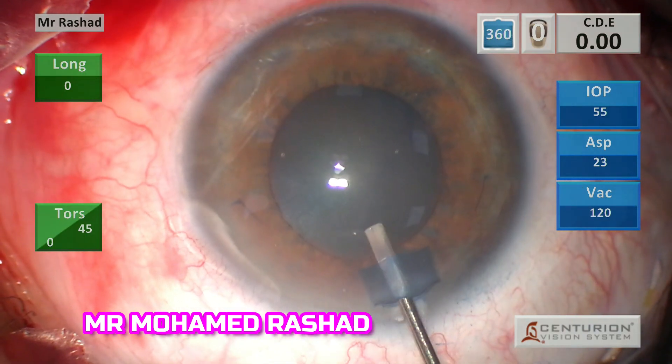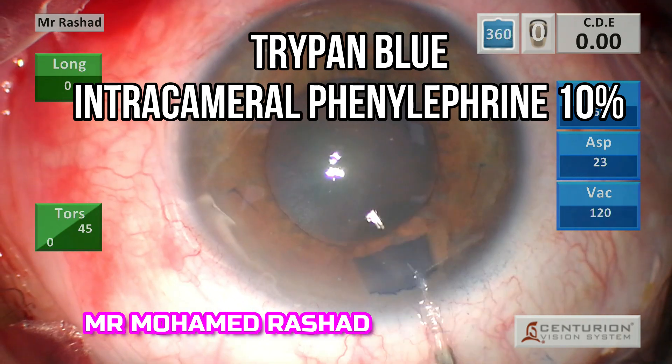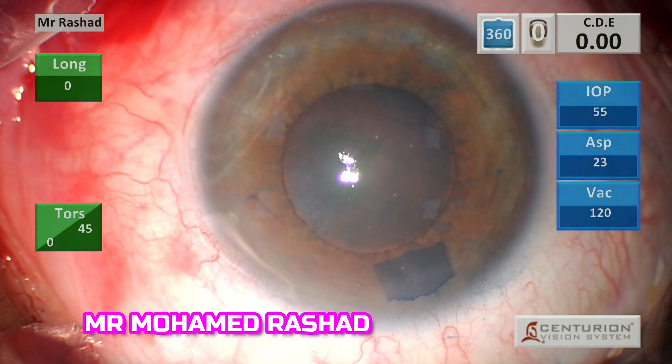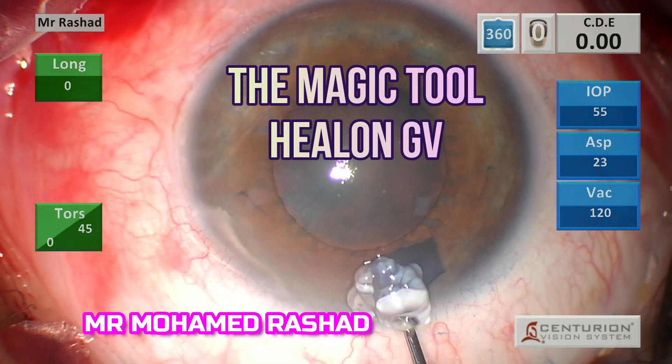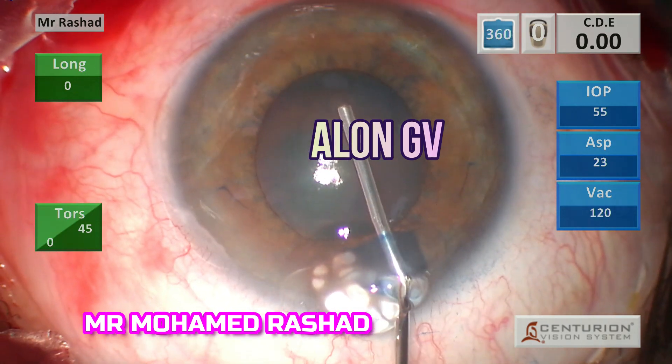Trypan blue and intracameral phenylephrine 10% are very important to aid with dilation. Then comes our magic tool, which is the Healon GV. I inject it at about 6 o'clock.